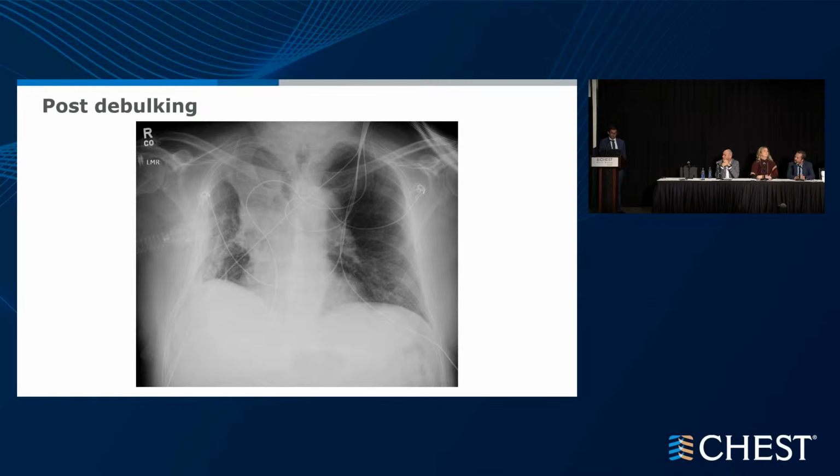Yeah. Probably. And that was my thought behind that, exactly. Glad you taught me well. Can we offer an alternative? So, I'm aligned, absolutely. If we can avoid foreign objects. But one of the first things I say when I talk about stents is they're designed by engineers, not by God. They are foreign objects in the airway. So not everyone tolerates stents. They're prone to complications.